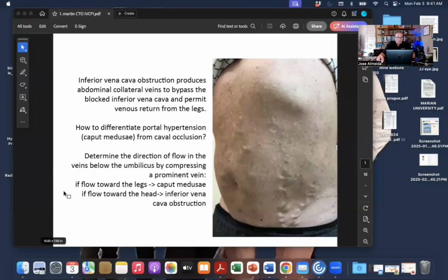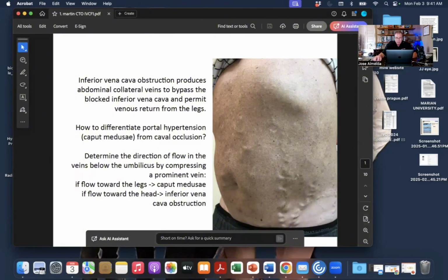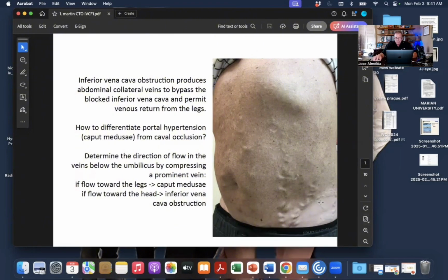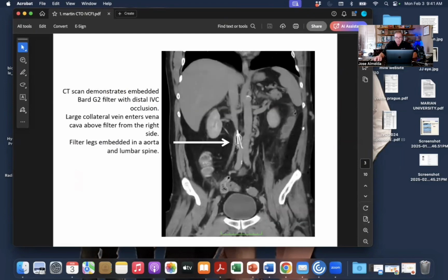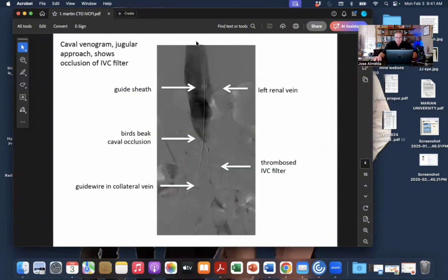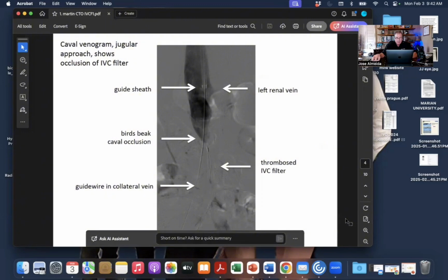So let me share the screen here. Hopefully you can see that. So this is him originally with the typical caval occlusion, venous collaterals on the abdomen pattern. This was his filter. As we often see, filter tines into the aorta and the lumbar spine. There you see complete penetration of the cava into the aorta. A nasty looking filter. Typical from above this sheath, a bird's beak occlusion of the vena cava. There's the filter and bilateral iliac vein occlusion.